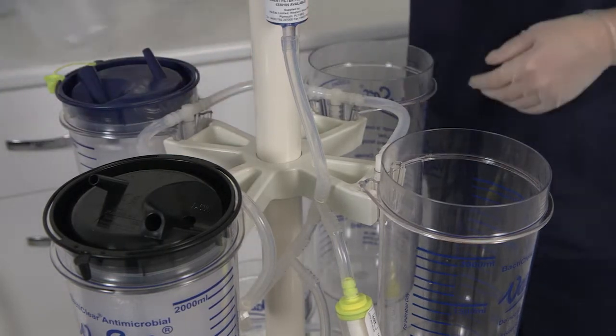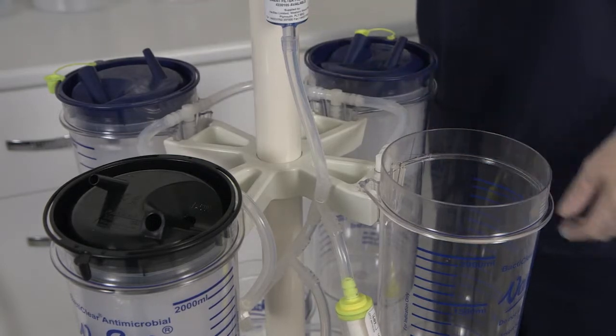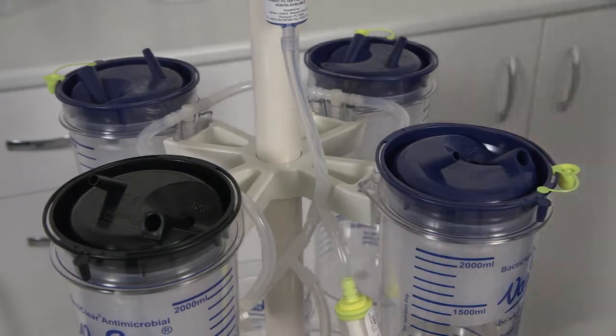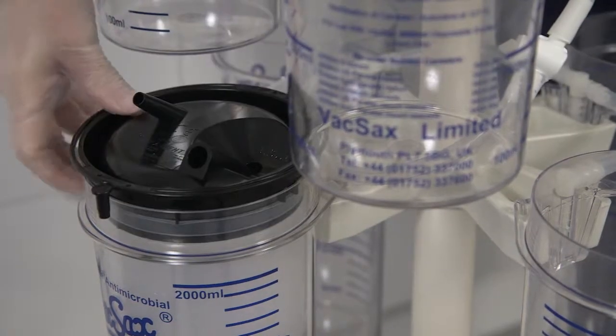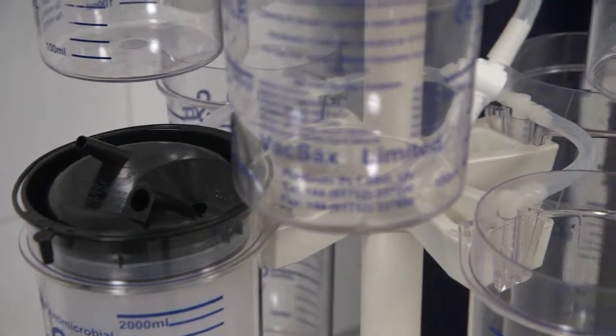Then place the remaining 3 blue top cascade liners into position, pushing them down into the canisters firmly. The first black lid standard liner is then placed beneath the top mounted black lid liner.